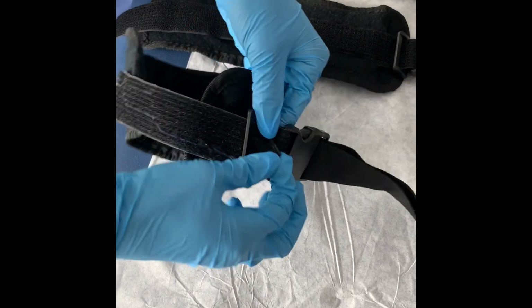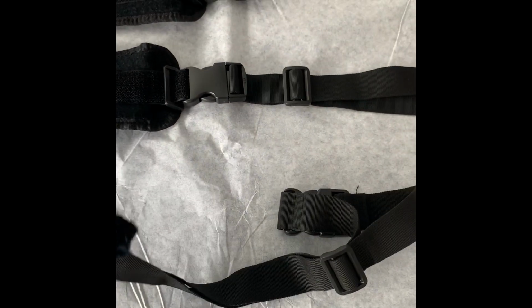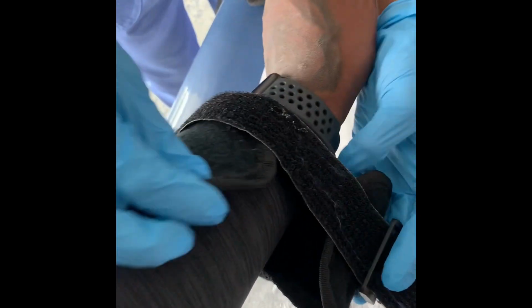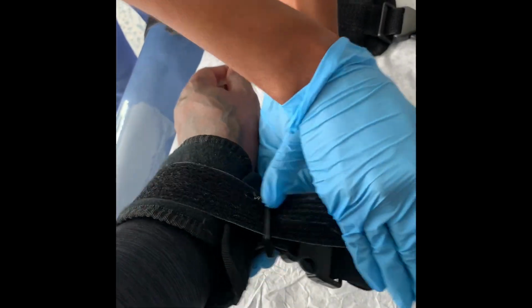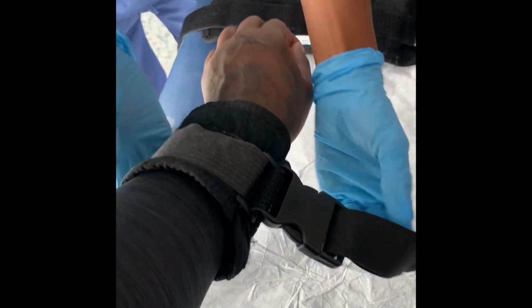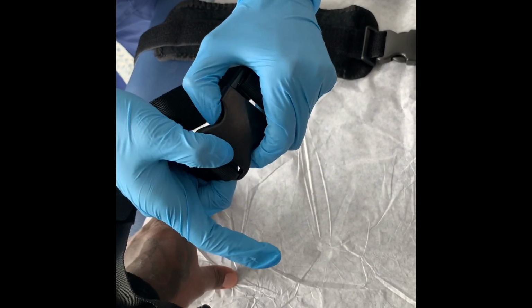As you can see, this restraint is actually made out of Velcro. You'll wrap this part around the patient's arms, the legs. As you can see, we're applying the restraints to the patient's arms, my arms. But yes, the restraints is actually being applied to my arms. This end right here, like I said, will get connected to the bed.